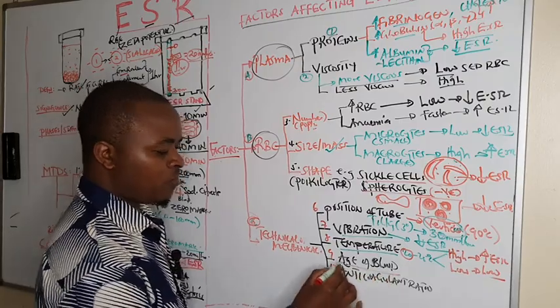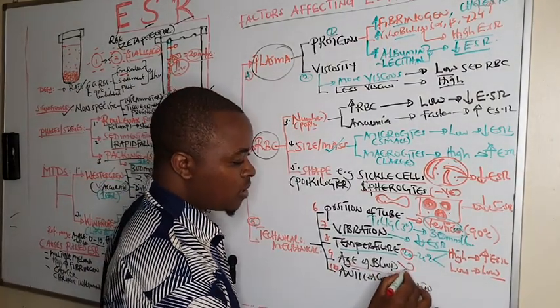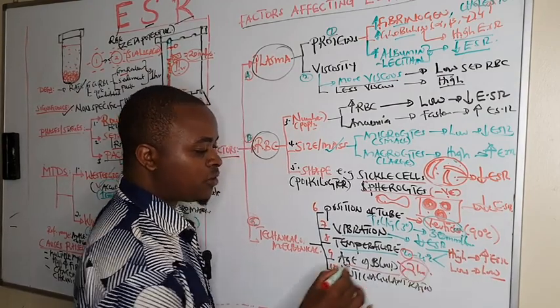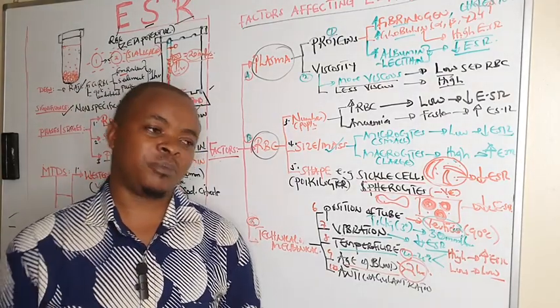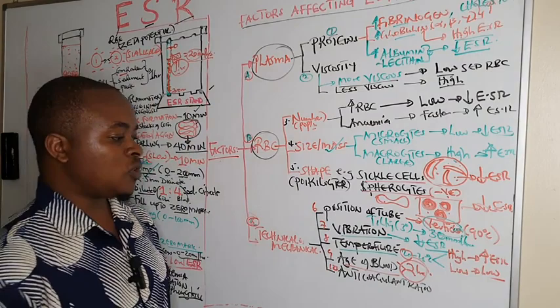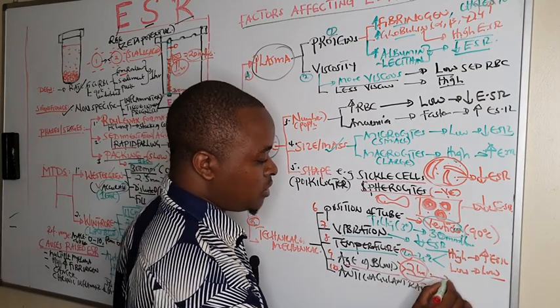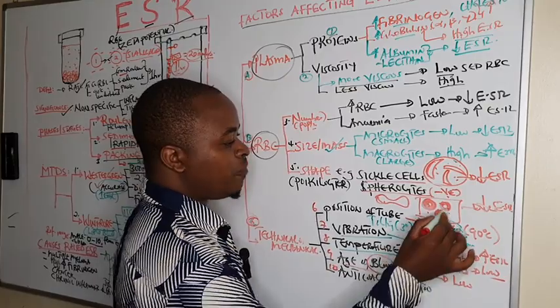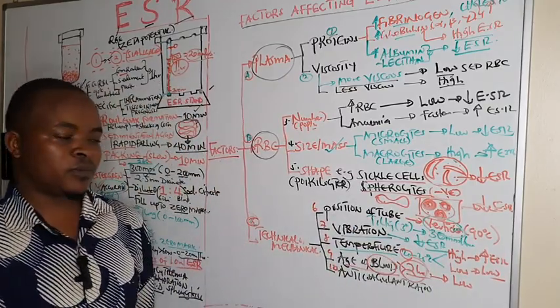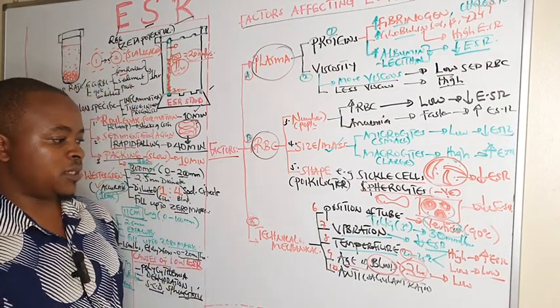What about the age of the blood? If you have left blood to stand for greater than 2 hours, meaning the ideal or the precaution, blood used for ESR should be freshly collected. Using blood collected after 2 hours at room temperature will lead to false low results because the cells will end up forming spherocytes and crenated RBCs, which will lead to low ESR results.